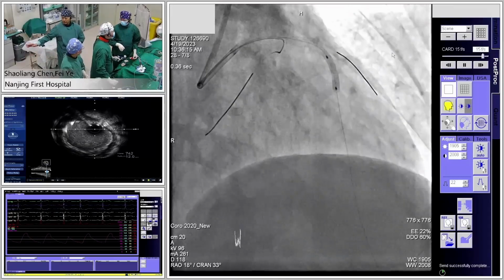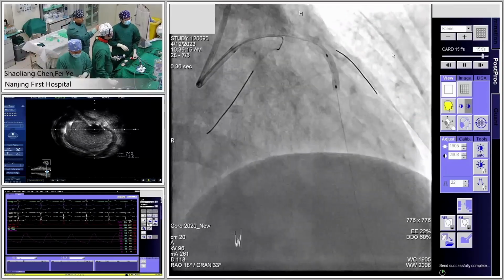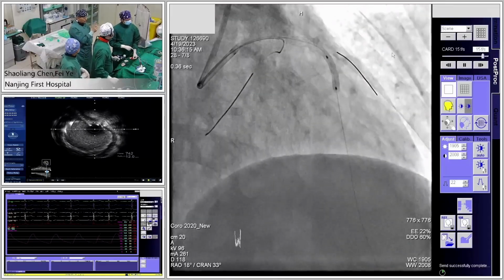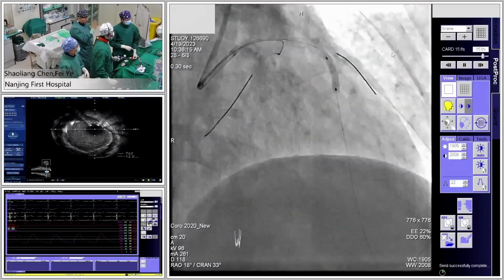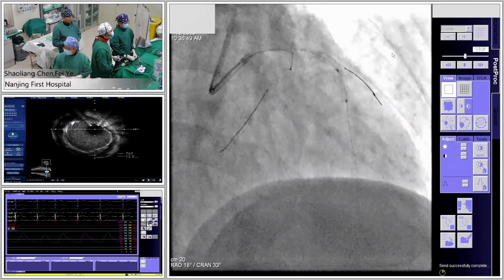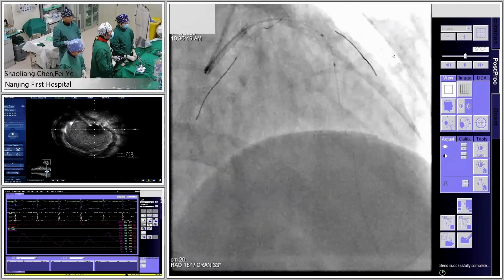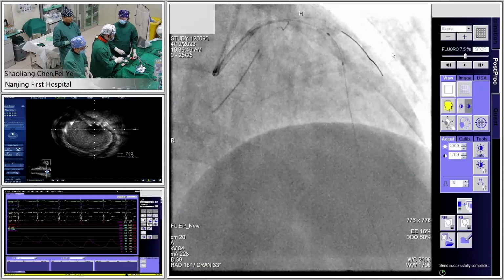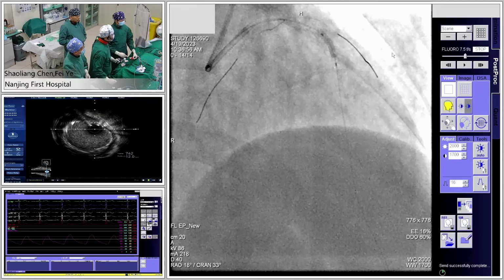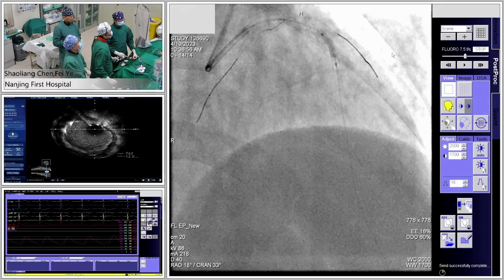I think we don't need a port balloon. From the angiography, you can see this is a conventional NC balloon. The proximal shoulder is pretty long, but the distal shoulder looks good. With short distal and proximal shoulders, it is much more difficult to fold the balloon. So I think the manufacturing of the port balloon will be technically a little bit difficult.